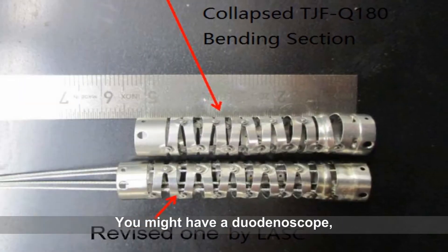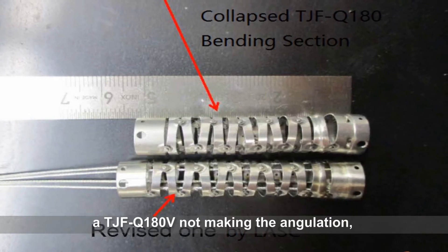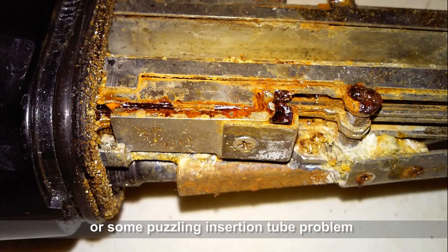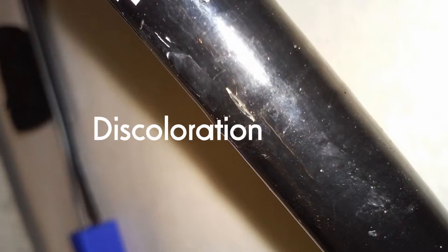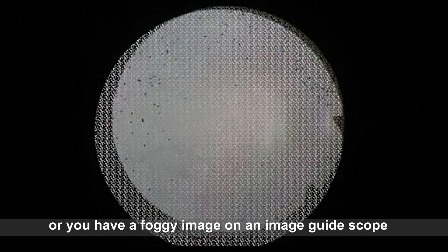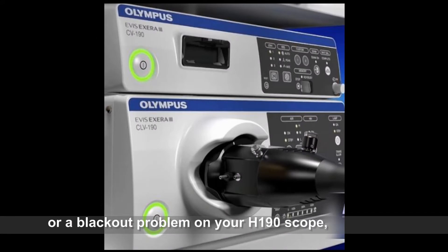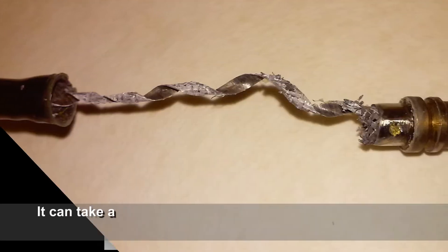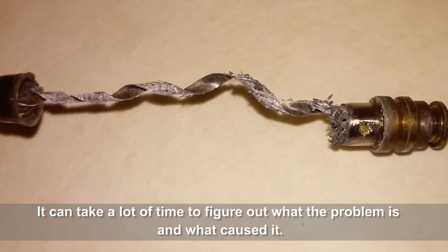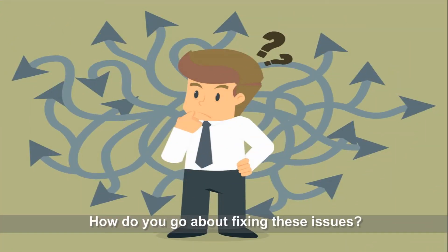You might have a duodenoscope TJFQ180V not making the angulation, or some puzzling insertion tube problem like blistering, buckling, or discoloration. Or you may have a foggy image on an image guide scope, or moiré patterns on your hybrid scope, or a blackout problem on your H190 scopes, and so on. It can take a lot of time to figure out what the problem is, what caused it, and how to go about fixing these issues.